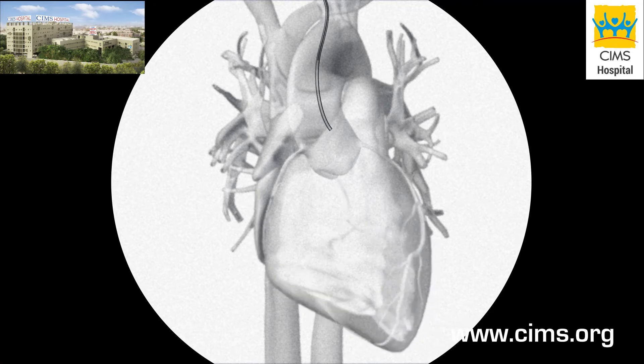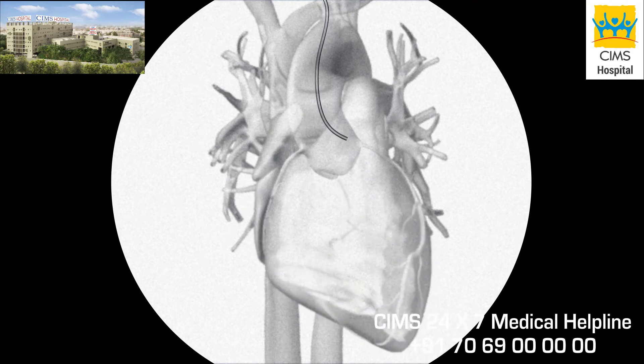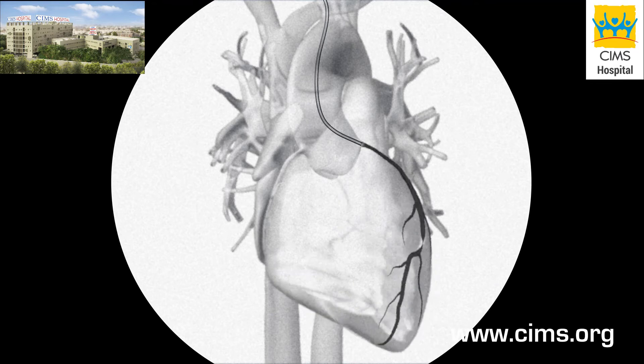At this point, your doctor will remove the guide wire, then move the tip of the catheter just inside the coronary artery to be examined. A special dye will be injected into the artery. This allows your doctor to view it better with a fluoroscope, and the dye will make any blockages in the artery stand out.